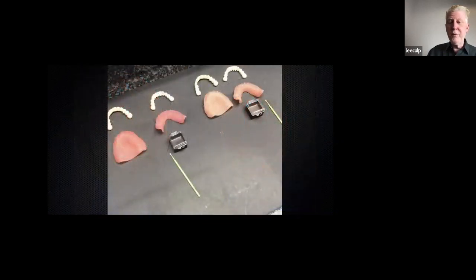This is the way we do dentures today. So you've got your denture base you've printed, you have your teeth you've printed, you have gone through the adjustments and made them more aesthetic, and now you're ready to bond them together. These are either milled or printed. If it's printed, then we don't add Connect. We want to very lightly sandblast the sockets of the teeth, and the sockets of the base, and we want to sandblast the teeth where they're going to be attached together.